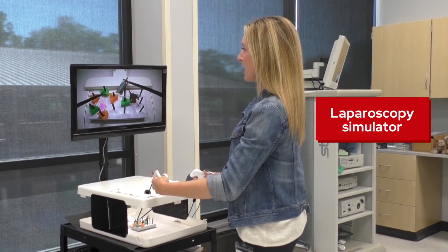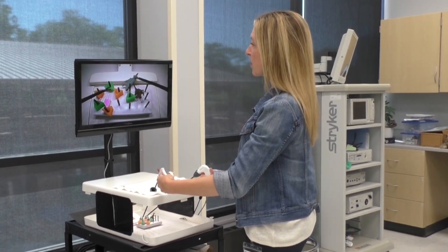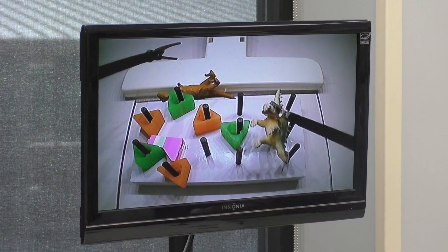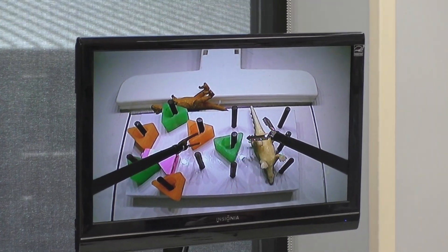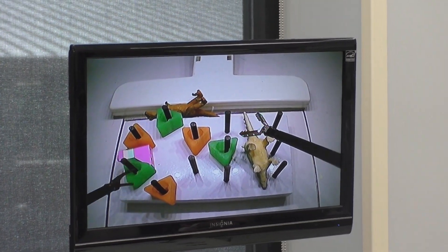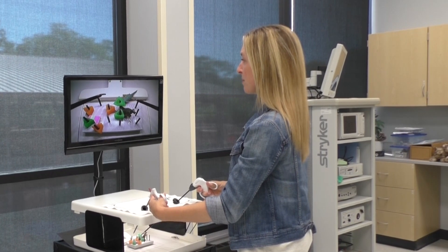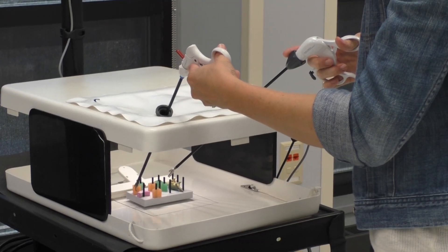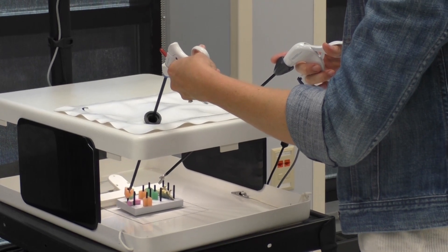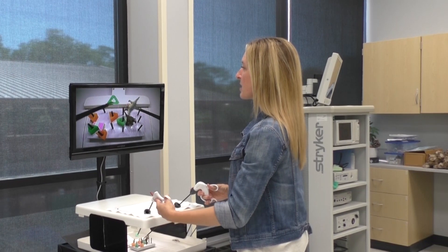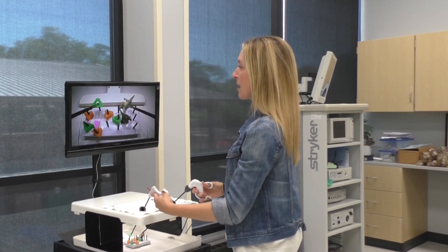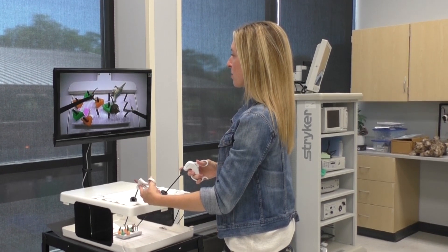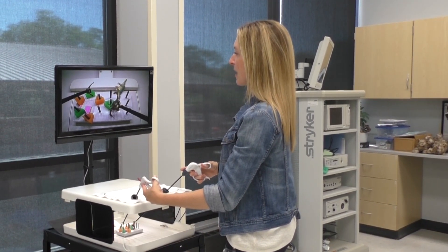This is our laparoscopy simulator, used to train learners in surgery, internal medicine, or general practice to develop the hand-eye screen coordination needed for laparoscopic procedures — watching a screen and translating that to what you're doing with tools inside the abdomen. We practice by moving fun figures like dinosaurs and stacking various shapes and colors on boards. This low-stakes environment helps learners feel confident and comfortable before performing these procedures in a body cavity, and because it's gamified, they'll keep practicing to improve.